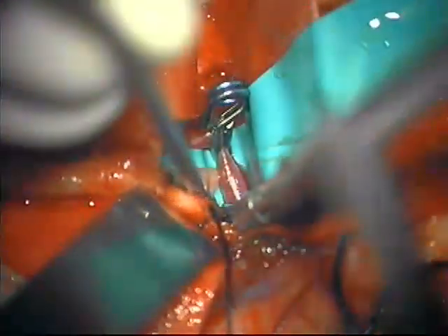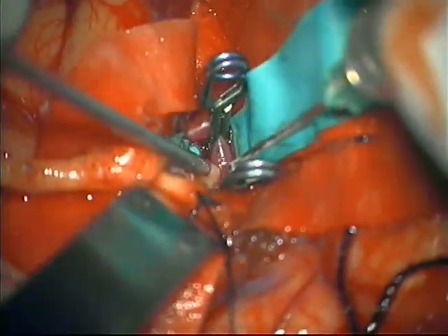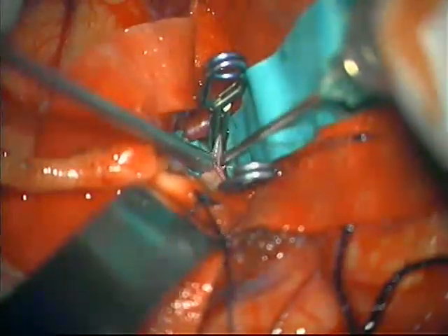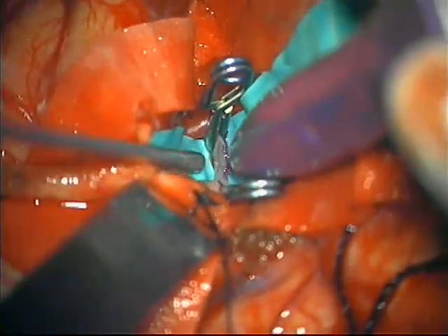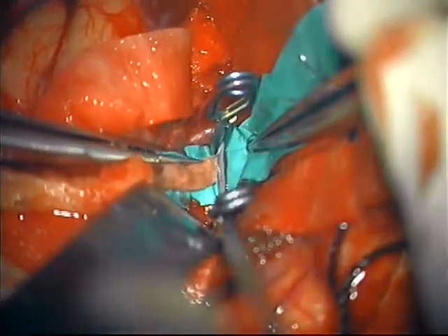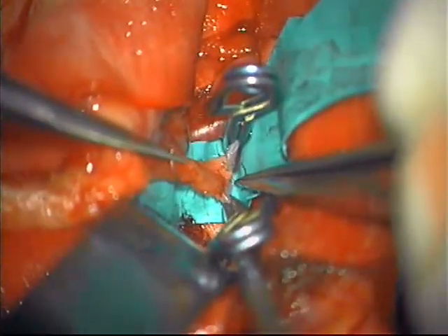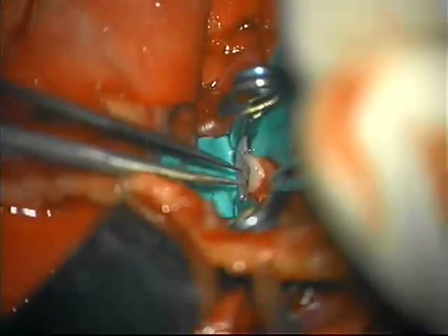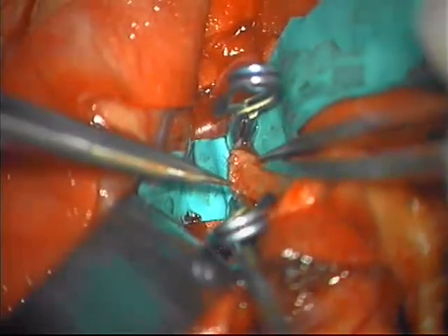The recipient artery is closed proximally and distally using temporary clips, and a small arteriotomy is performed using the hypodermic needle. We use a violet dye to make the borders of the arteriotomy more visible. The bypass is completed using two lines of 10-0 nylon sutures. Previous to this intracranial anastomosis, the anastomosis between the external carotid artery and the radial artery had been completed.